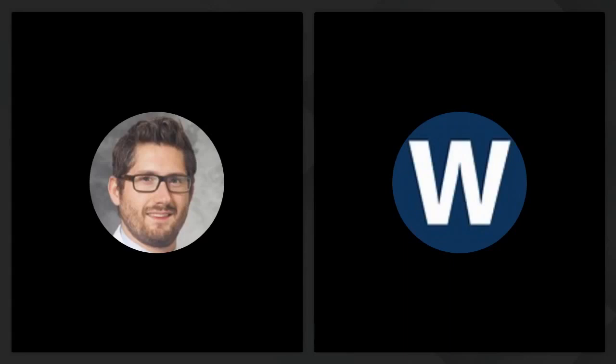Normally, the best way to learn about how that's done is by looking at the vendor's specific materials. Usually they describe how their algorithms work and what the differences are. I can't remember if Task Group 218 discusses this, but that might also be a good reference. And finally, one of the best ways to learn about things like this is to do analysis with both and just see how it affects the gamma passing rates, and then decide as an institution or as a clinic which one you want to use and document that and make that standard procedure.